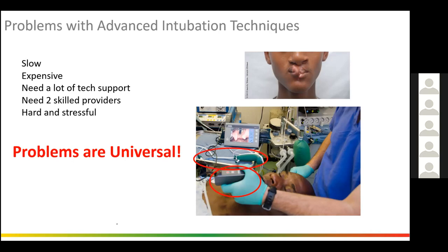And then we had a whole bunch of Ambu scopes, but like all good aid organizations, somebody had donated 20 Ambu scopes, but no screen. So we couldn't actually visualize through them. And I used it as a dynamic stylet and found I was able to intubate him very quickly and easily. And that's really where I got started on trying to develop a purpose-built dynamic stylet instead of cross-purposing fiber optic bronchoscopes.